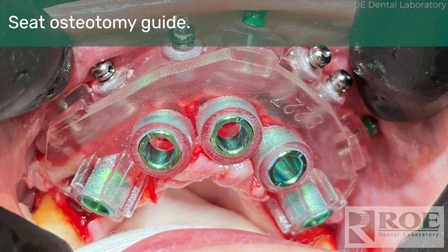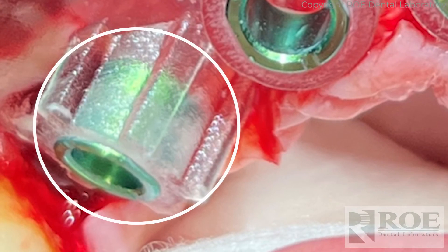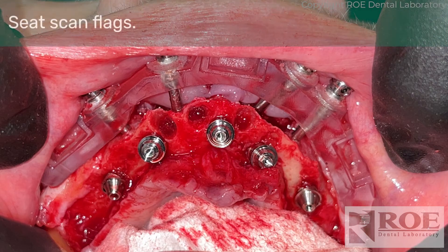Once the bone is reduced, the osteotomy guide is seated. This is a BioHorizon guided kit, as you can see by the master tube sleeves inserted. Rotation indexing is controlled by two things: a small slot in the sleeve, and nubs on the plastic guide to indicate rotation — there's a notch in the sleeve that matches up with one of these nubs. Implant rotation is critical, and it's nice to have that guided as opposed to freehand; this system pretty much guarantees they'll be straight up and down. After creating osteotomies, the implants are placed through the guide. Implants are in, MUAs are on, and the next step is photogrammetry scanning.